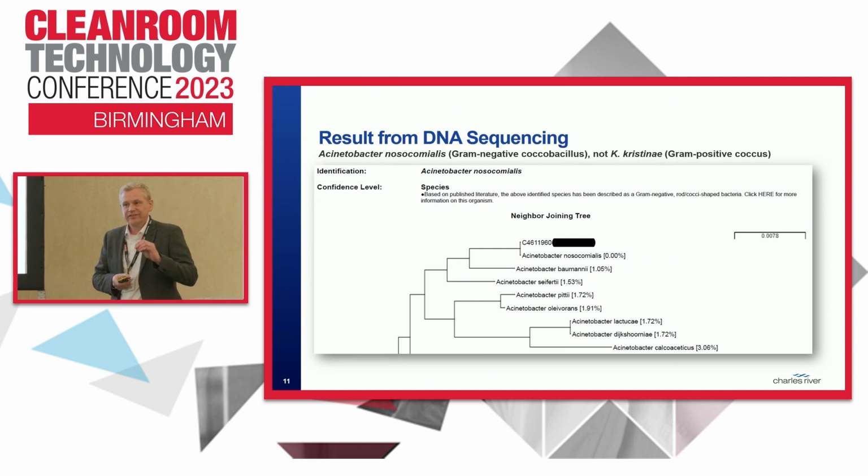And the importance of the ID, especially during an investigation, can't be stressed enough. An investigation for a gram-positive human-associated organism will look very different to an investigation looking for a gram-negative environmental isolate.